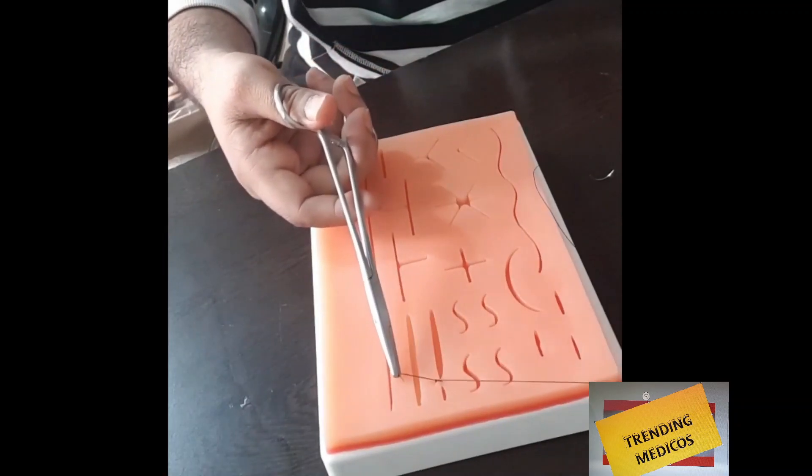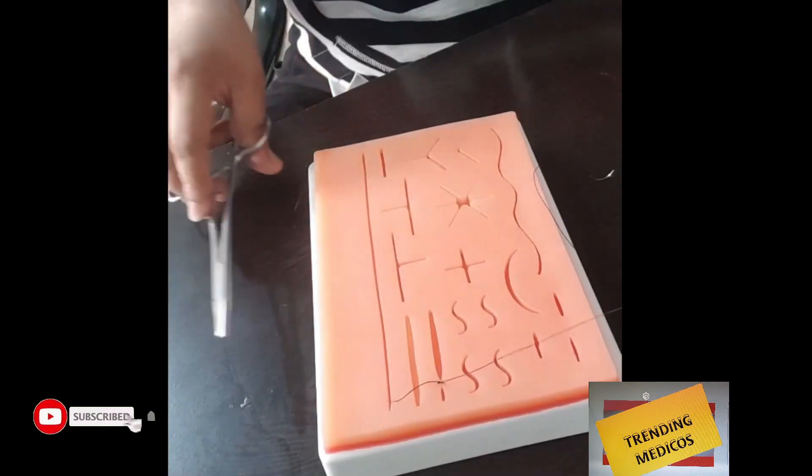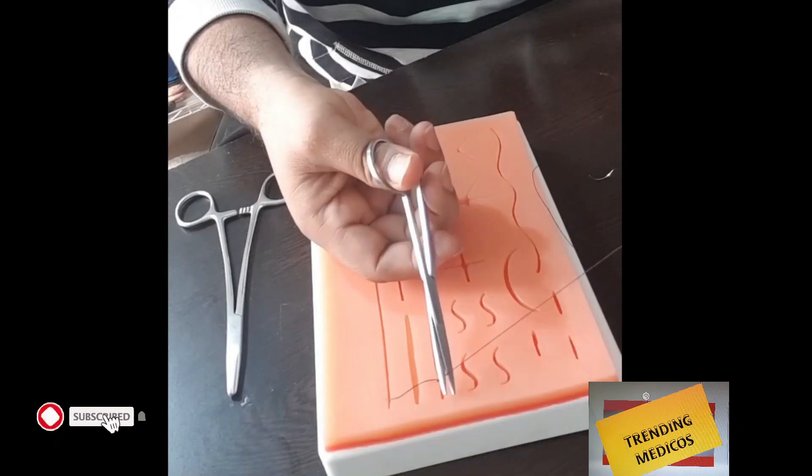I'm taking only two sutures because this is a practice pad. Otherwise, you should take at least three or four, depending on the suture material. Now cut the long thread, and also the shorter thread needs cutting.